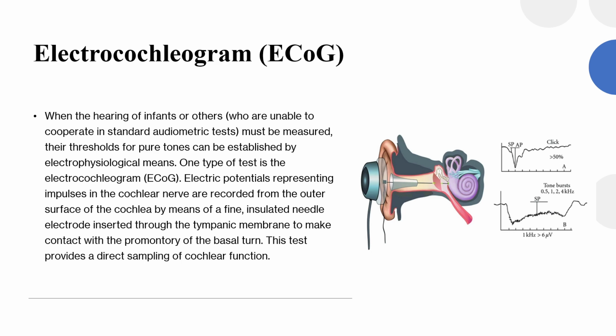This test provides a direct sampling of cochlear function.